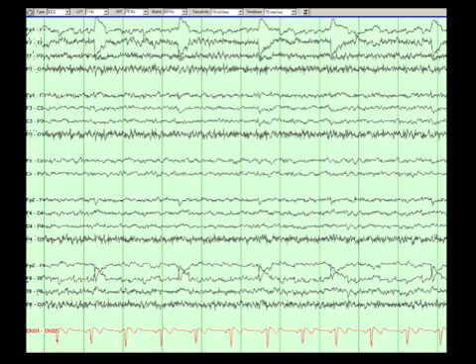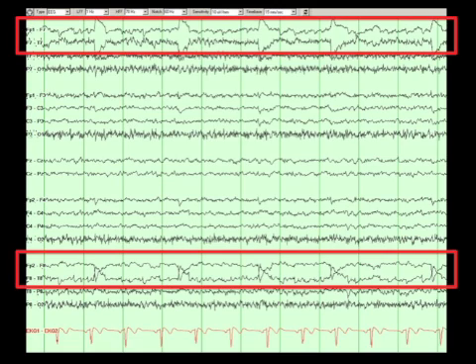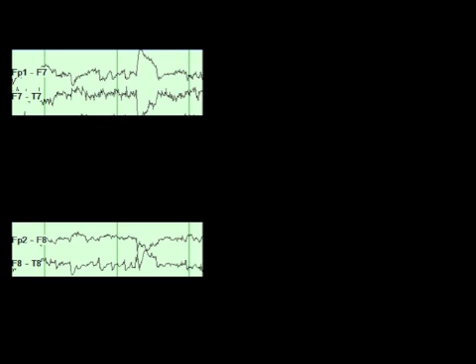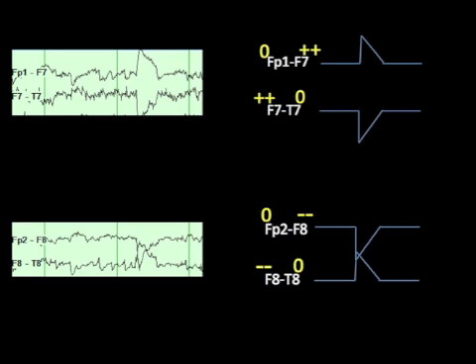We can look at a sample recording of a patient who is having some leftward saccadic eye movements. In this case, the patient is actually reading a book. If we outline the channels that we have already predicted, and look at them more carefully, we see that our predictions, based on the polarity of the eye, and our polarity rules, are accurate.